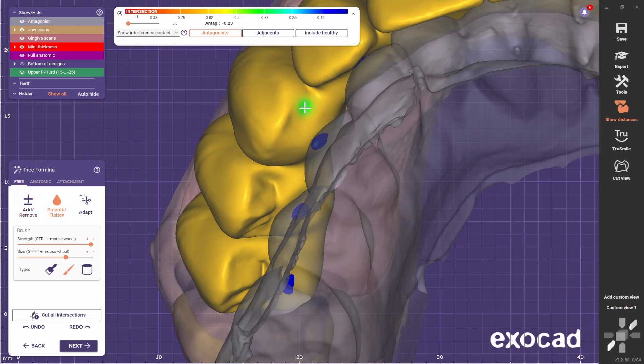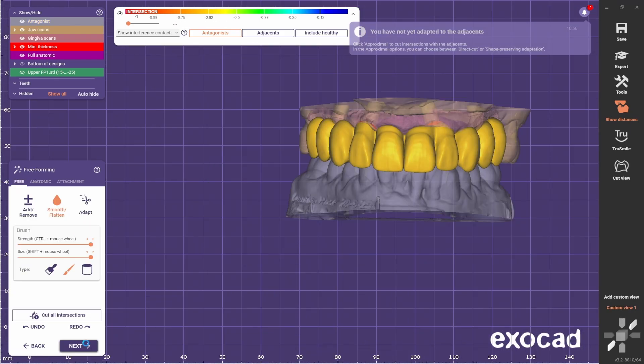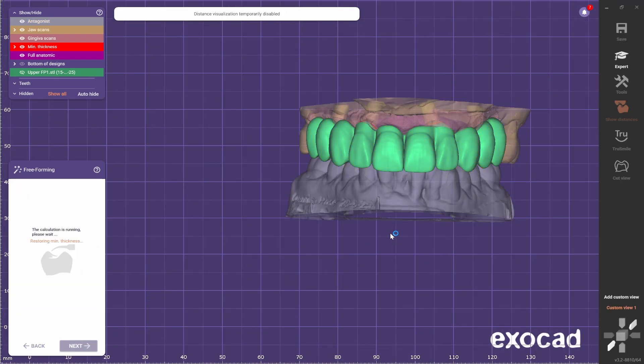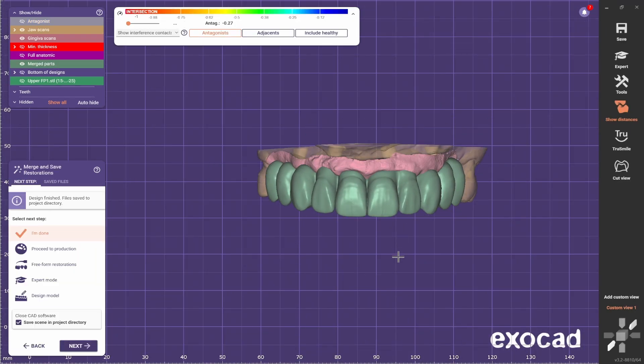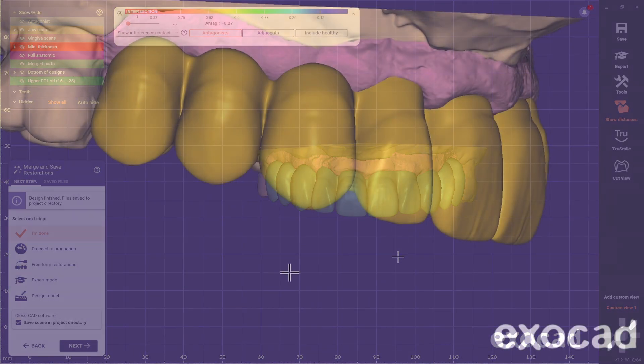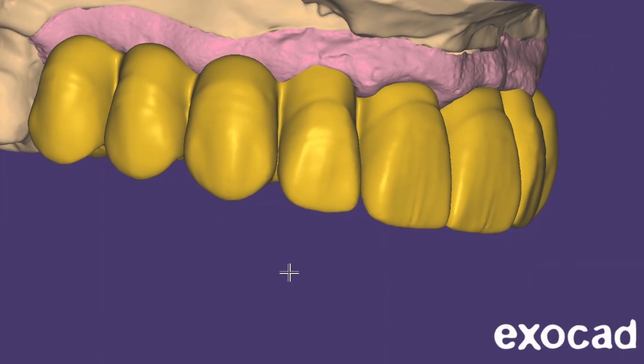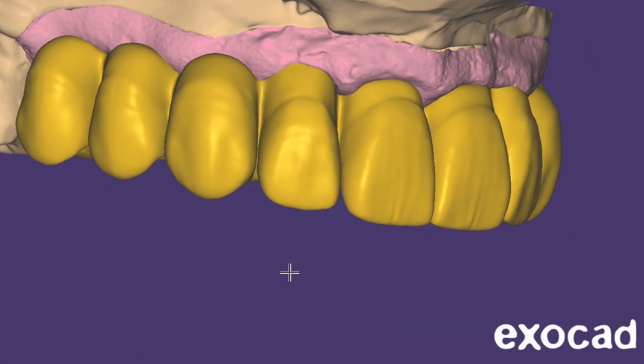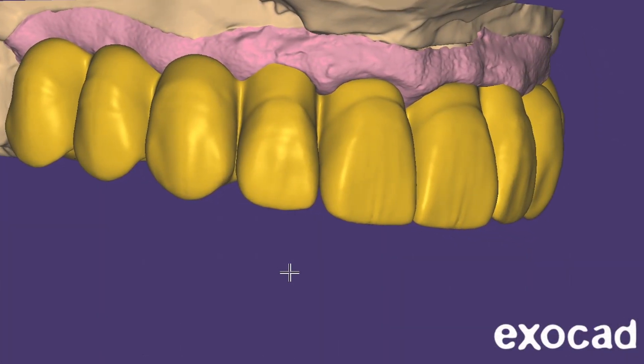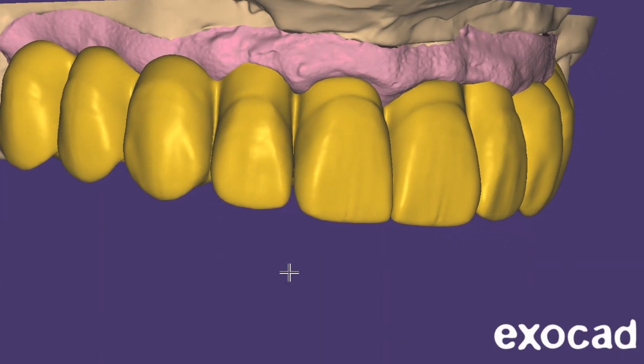And this is how you can do a nice looking bridge on a big case quite quickly, outside of the normal workflow. This technique shines with FP3 cases, so watch this video next where I show you that you can do a full arch in less than 10 minutes.